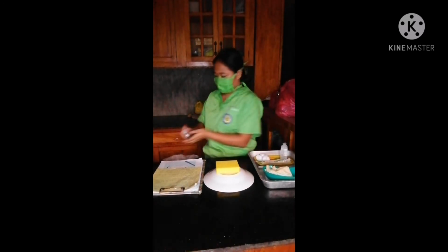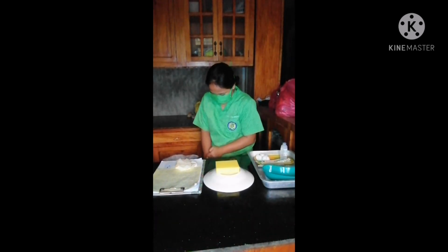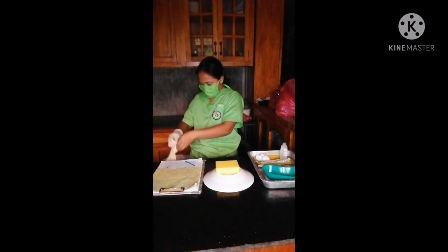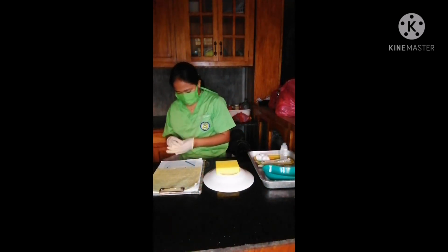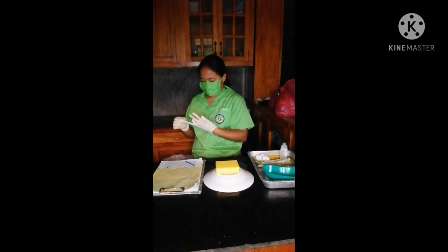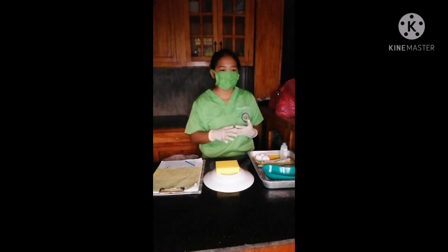Perform hand hygiene. Put on gloves. Select an appropriate administration site.